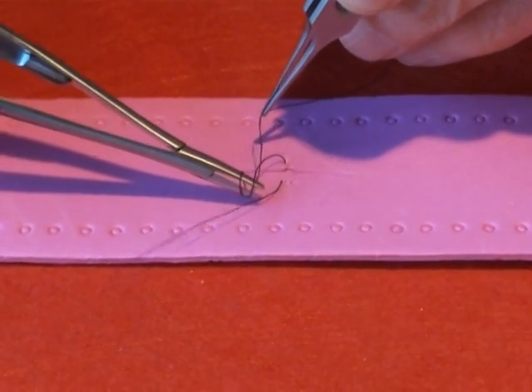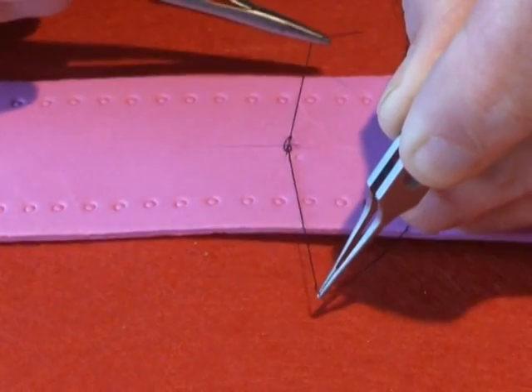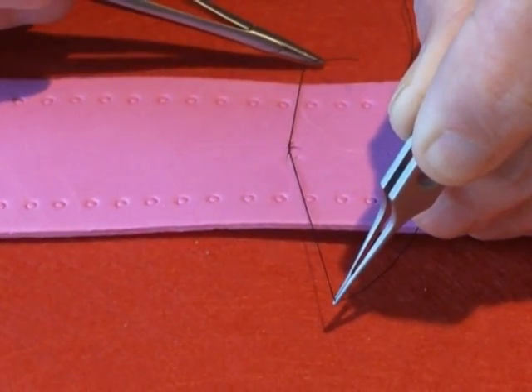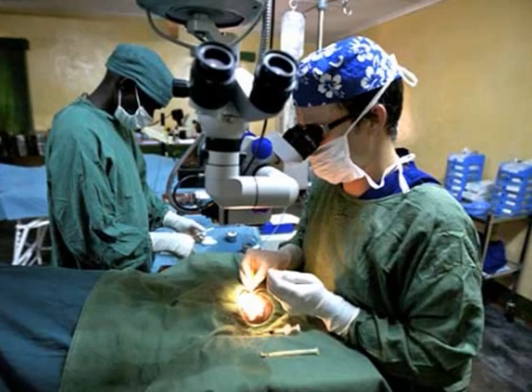Practice first with the naked eye using sheets of polystyrene foam or something similar, and then practice under the microscope using animal or artificial eyes if you can. When you are totally competent and relaxed with the techniques, you are then ready to operate on patients with supervision.